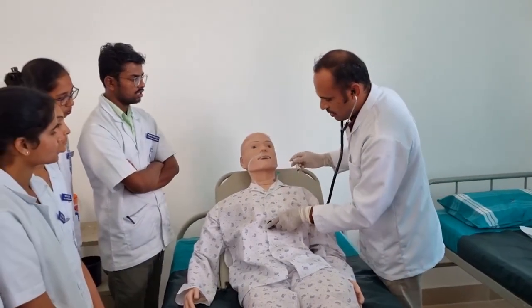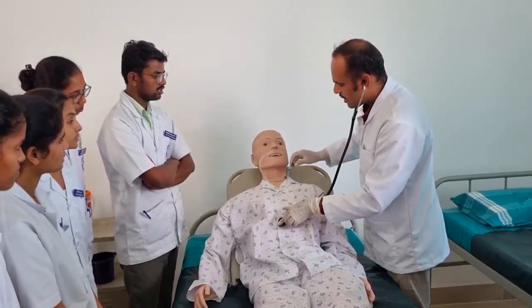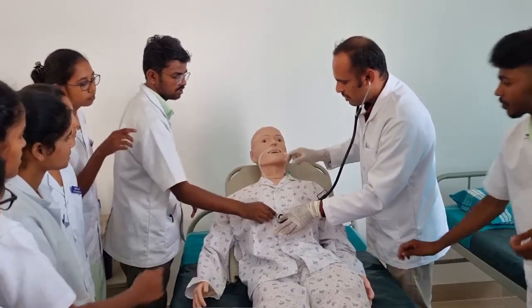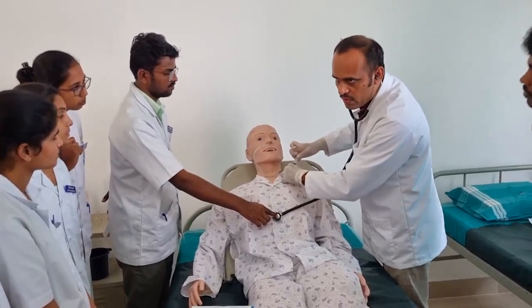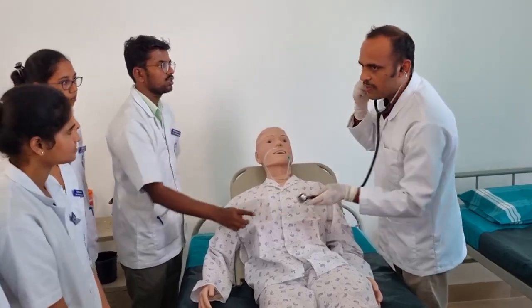So if you are holding a stethoscope at the stomach level and pushing air into the NG tube, the sound will be heard at the stomach. That is the confirmation.